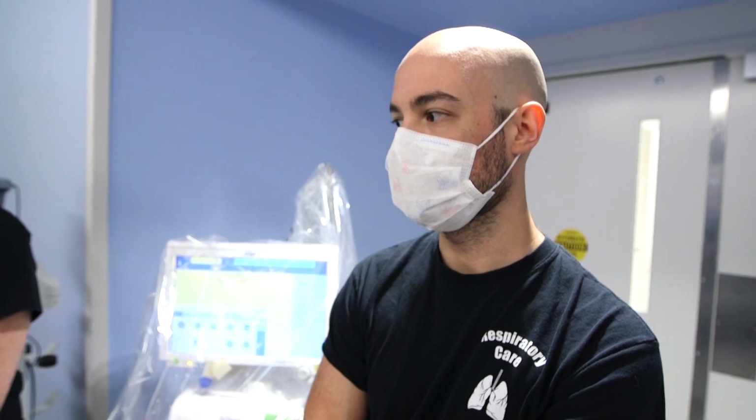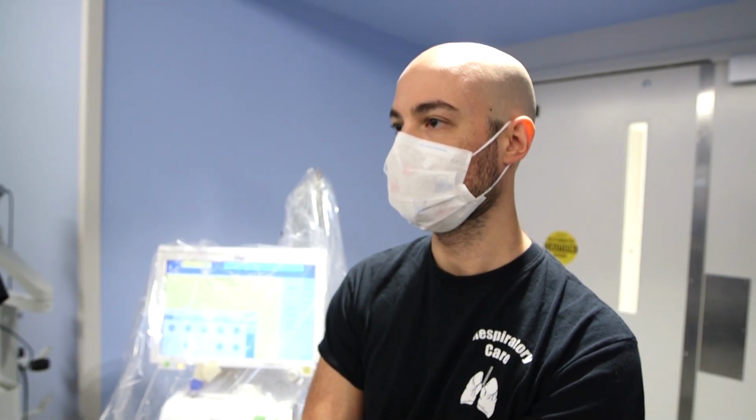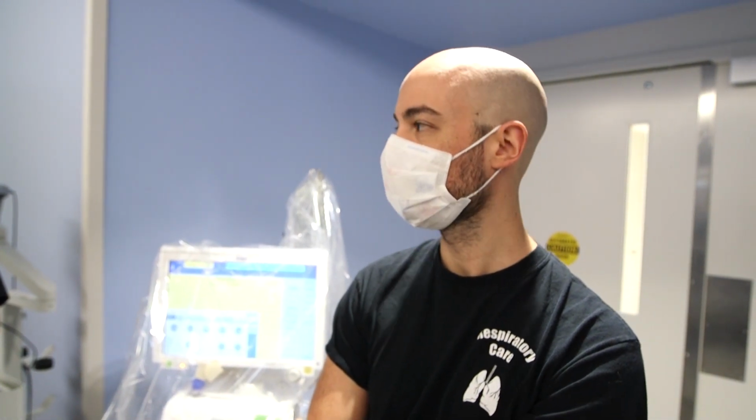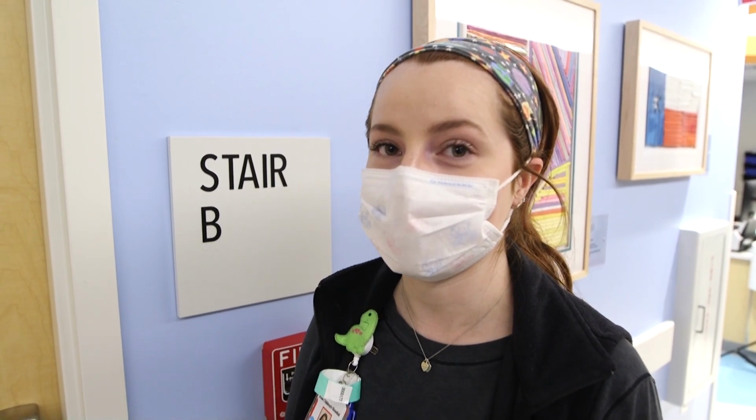I'm Dexter. I'll be the outside RT. I'll be responsible for equipment and shuttling equipment in between the rooms. And I'm Kayla. I'm the bedside RT. I'll be inside the room assisting with the intubation. I'm Maddie. I'll be outside the room, and I'm a runner.